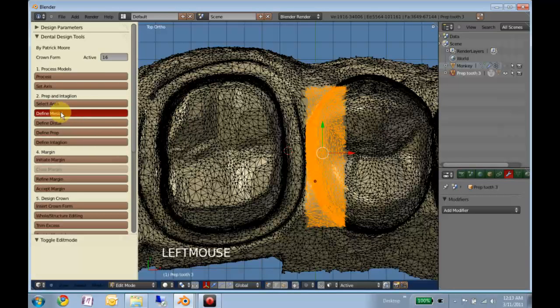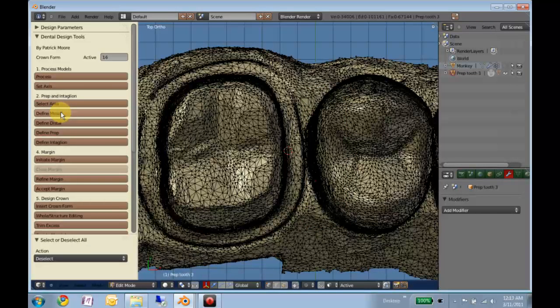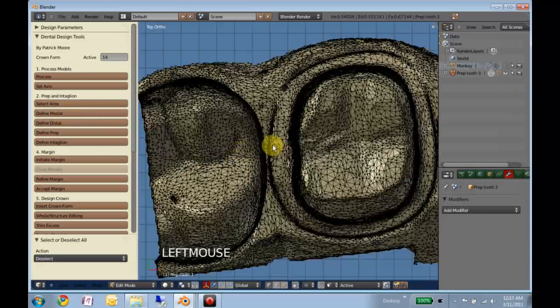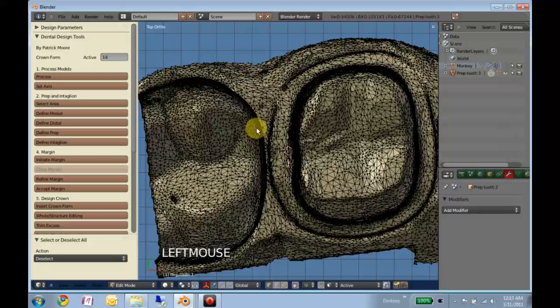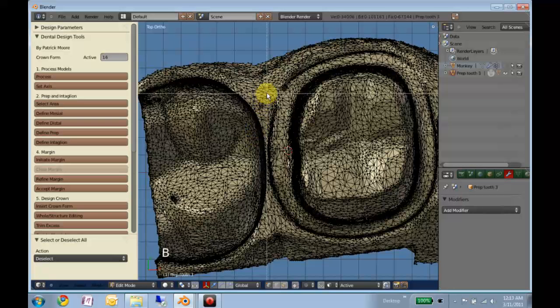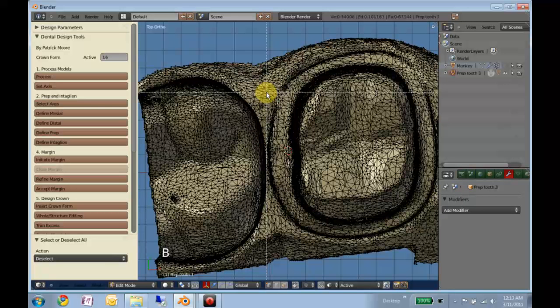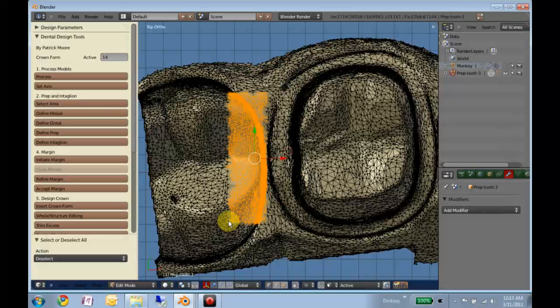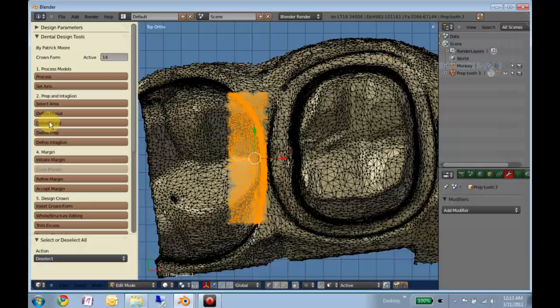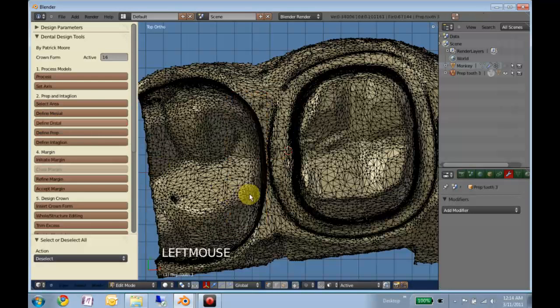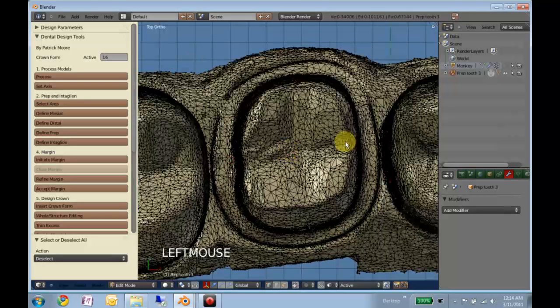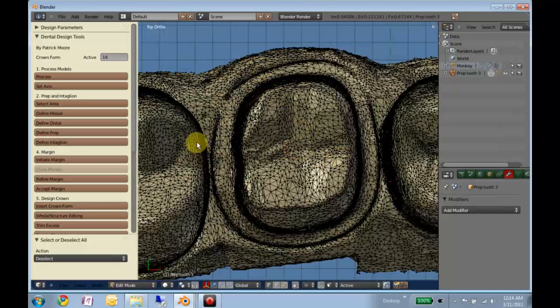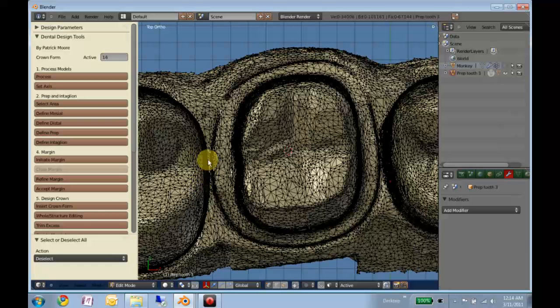Define mesial. Come back here. Hit B again. Define distal. And you don't have to be that skimpy with your selections. You can get more of the tooth, but it doesn't really matter. You just need a good surface that the contact is going to be made on.